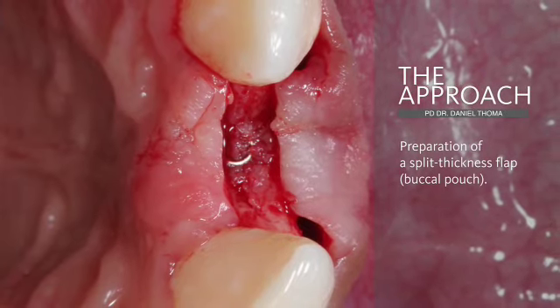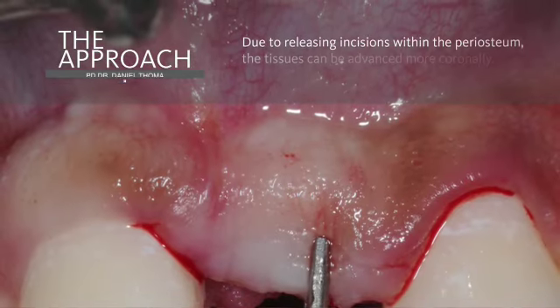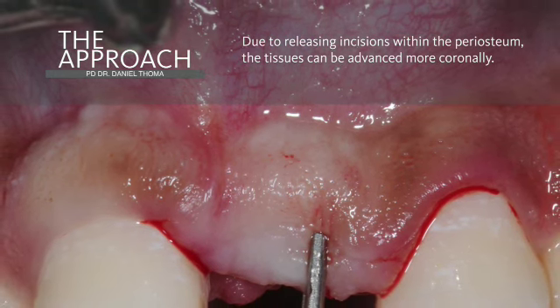As a first step to perform the soft tissue grafting procedure, a split thickness flap is prepared crestally on top of the implant, but also on the buccal side. Following the preparation of the split thickness flap, and also due to the releasing incision in the periosteum, we're able to advance the flap more coronally.